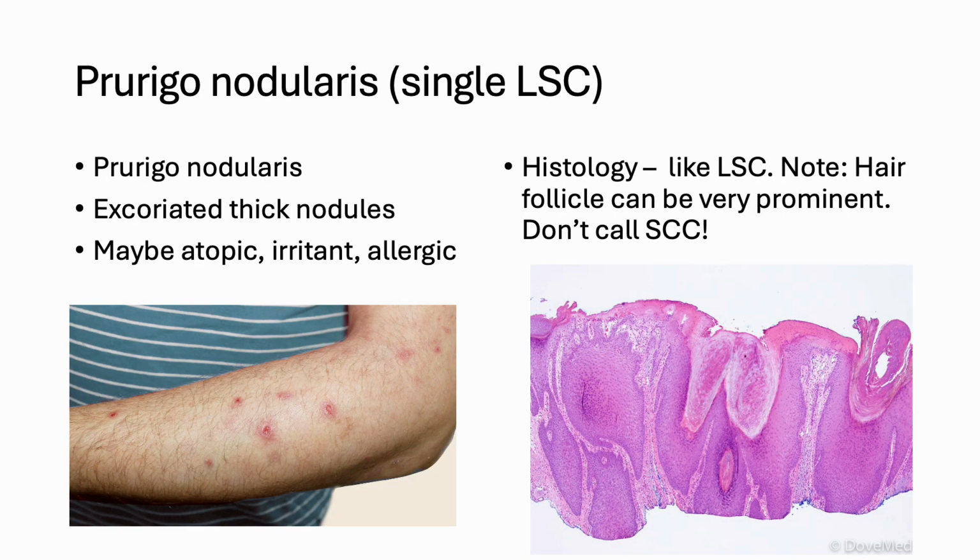I would like to add one disorder, which is the prurigo nodularis. Remember the lichen simplex chronicus we saw in the previous slide. It has a very diffuse patch. However, prurigo nodularis looks like little nodules. People give this one another terminology, Picker's nodule, and it's just an excoriation on the very thick nodules.